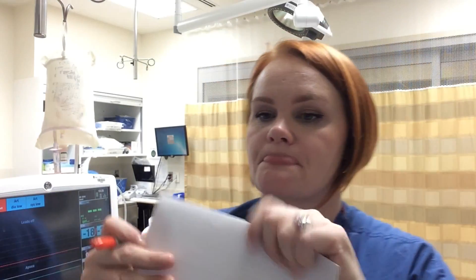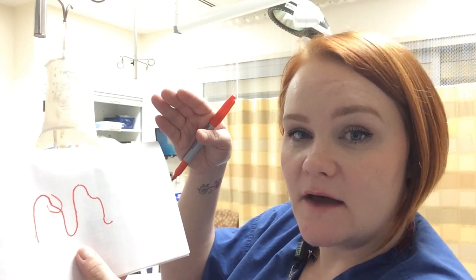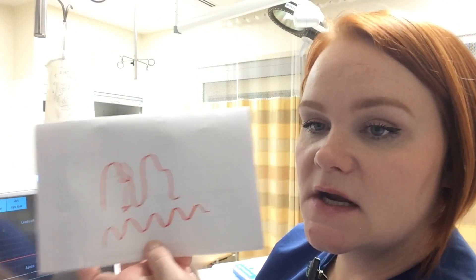Now let's look at waveform interpretation. A normal arterial waveform goes up sharply — that's systole, the contraction of the heart — then comes down, with a small notch called the dicrotic notch, caused by blood rebounding against the aortic valve. Then it continues down to diastole. You should see a symmetrical, even waveform. A dampened waveform, by contrast, will have no dicrotic notch — it will just be wavy or squatty and won't look right.